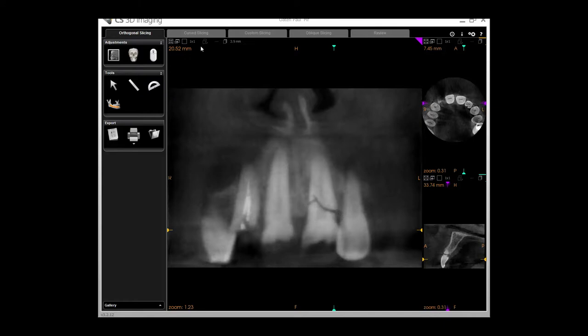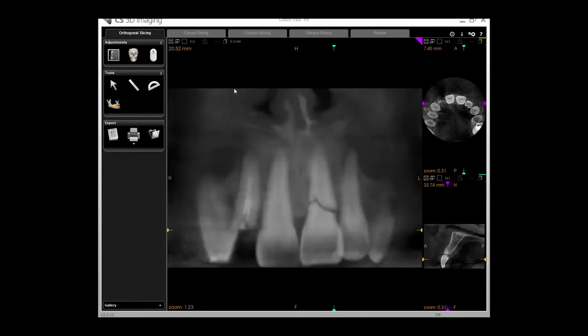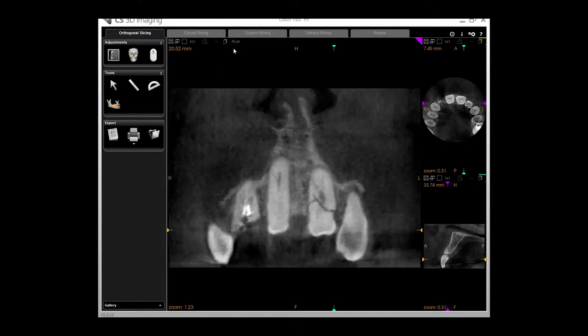This is really useful to get different layers and a different appreciation of what is going on, particularly in cases like this. This is not available in many other scan platforms. I can go from 76 microns all the way up to 10mm with different levels of thickness, which is really helpful and useful.